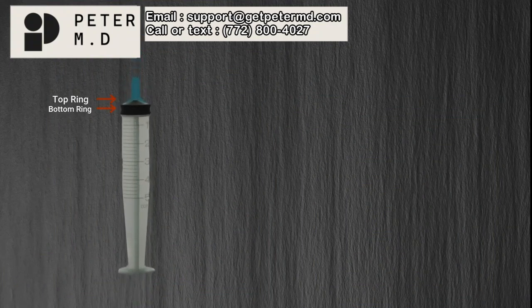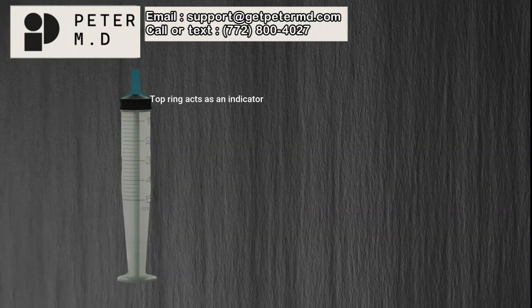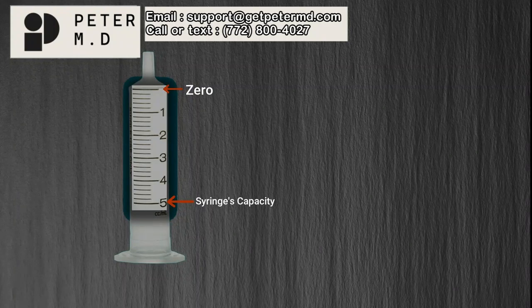You will notice that the stopper has a top ring and a bottom ring. The top ring acts as an indicator for measuring the medication contained within the barrel of the syringe. On the barrel are bold graduation marks, which allow for the measurement of the syringe's contents. The first graduation mark represents zero, while the last graduation mark represents the syringe's capacity — the total amount the syringe was designed to hold.